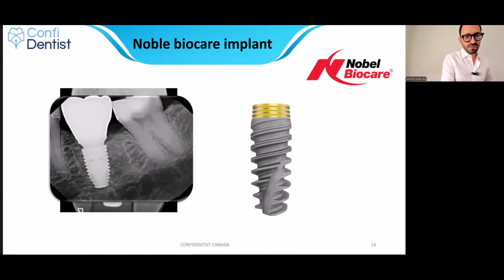Okay. Another example, you can see the threads, the platform switching. Once I see the platform switching, it's very obvious. This is a case of bone level implant. In this case, it was placed subcrestally. Okay. Composite restoration, remnant of lamina dura.